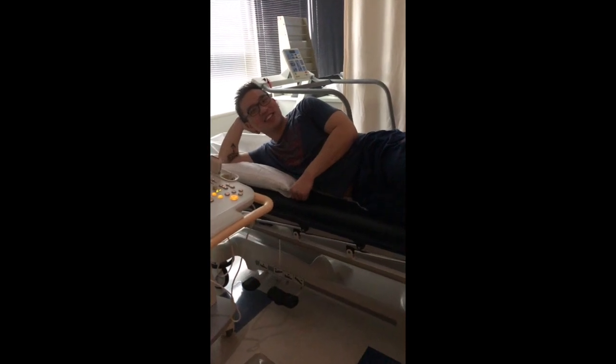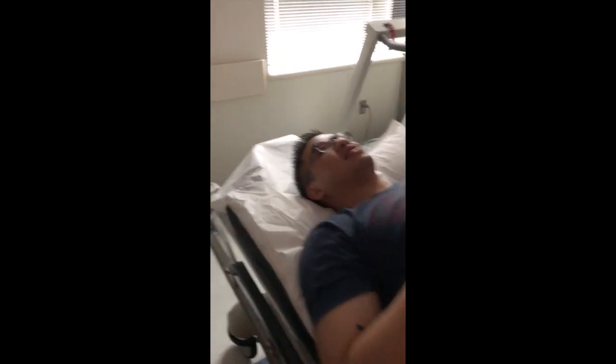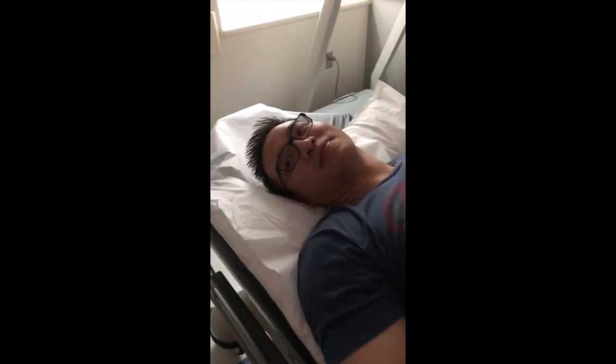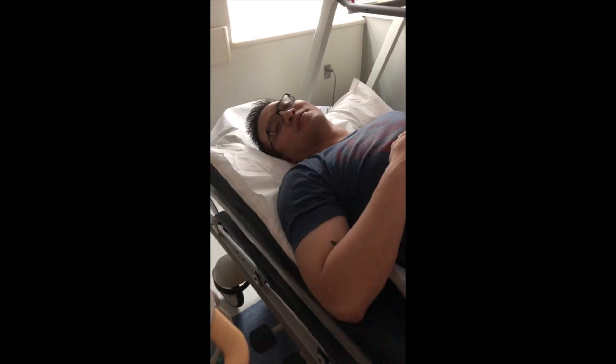Okay, alright. Well, we're gonna do a scrotum ultrasound today. It's not gonna hurt. I will use this transducer and we're gonna put gel on your scrotum area. But first, I need you to set up. I will be leaving the room. You can cover yourself with this drape.